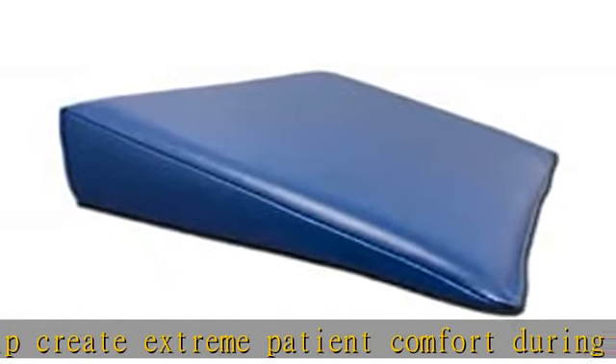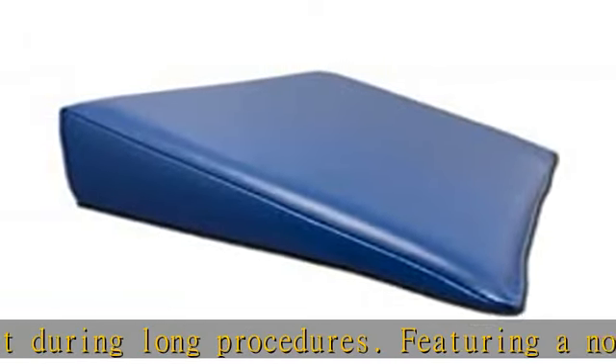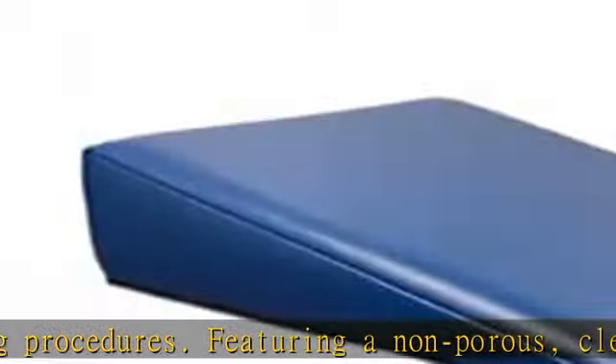Stealth sponges are designed with proprietary flared angles to offer significantly reduced artifacts during viewing. Flared sides will increase overall size.